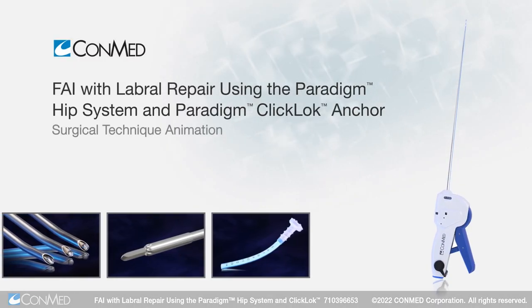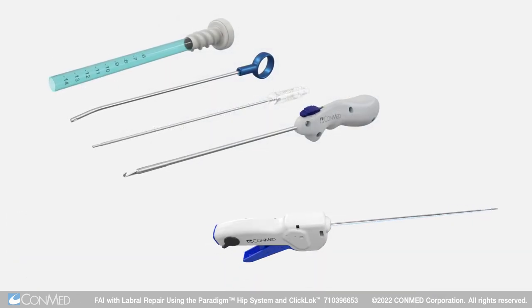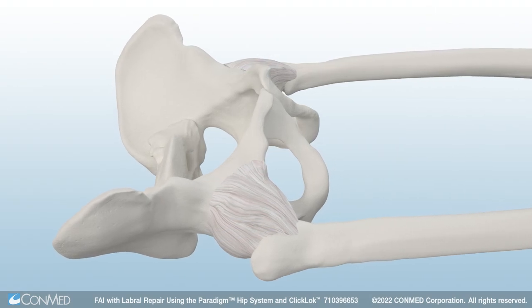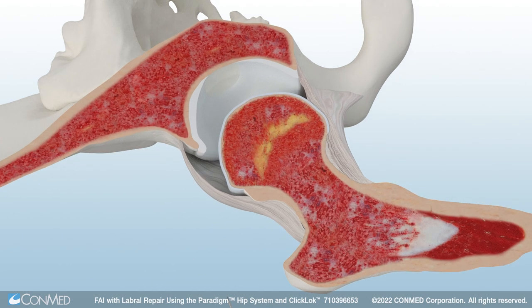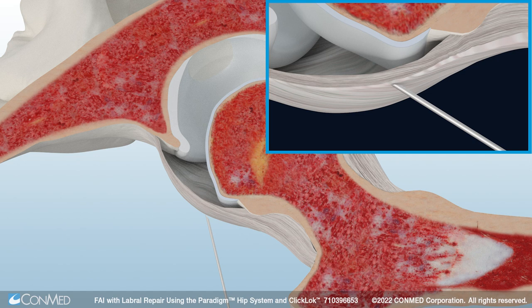Femoroacetabular impingement with labral repair can be treated arthroscopically using ConMed's Paradigm hip system. To begin, distract the hip to gain access and visibility into the hip joint. Use the Paradigm tactile needle to create the initial portal into the joint. The tactile needle features a spring-loaded blunt obturator for the open joint space that is designed to reduce the risk of damage to anatomical structures.